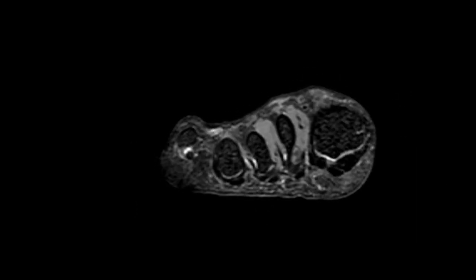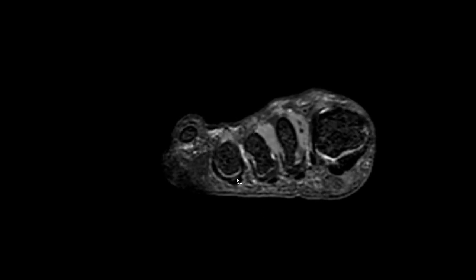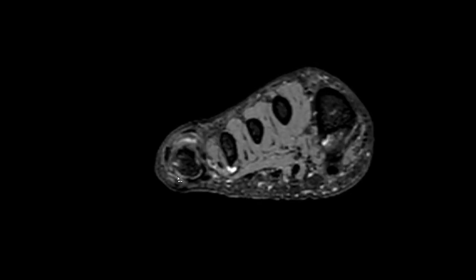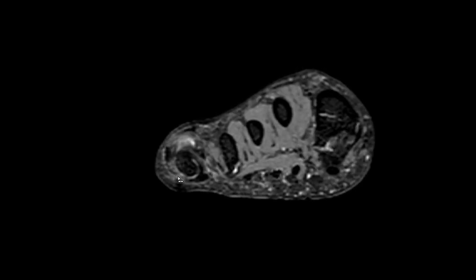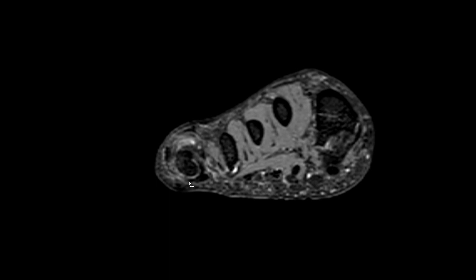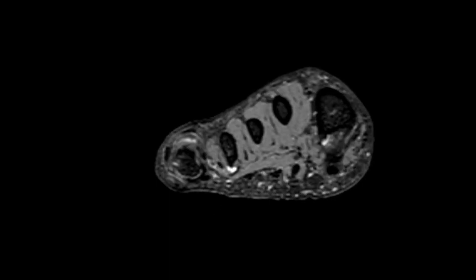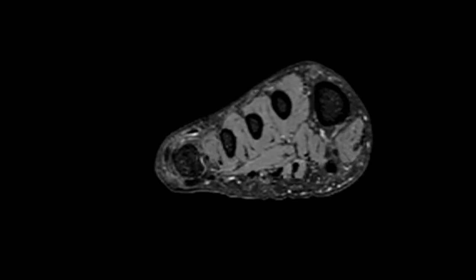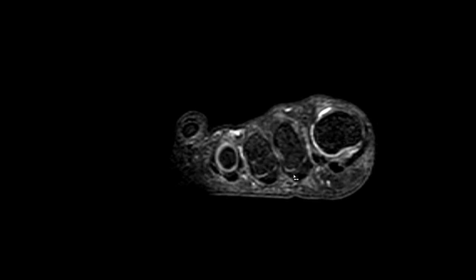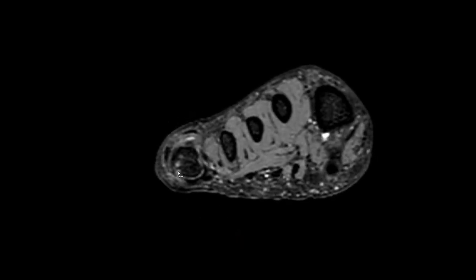On the axial view, using the fourth joint for reference, you have the U-shaped form with the plantar plate and accessory collateral ligaments. Going to the fifth joint, you can somewhat appreciate the plantar plate, but there is fluid intensity where the accessory collateral ligament should be — this is a plantar plate tear at this location. Note that most plantar plate tears actually occur at the lateral portion of this U-form, because during walking or wearing high heels the metatarsal heads are slightly tilted laterally, so the forces impact on the lateral portions of the plantar plate complex. That is why most tears occur at this location.